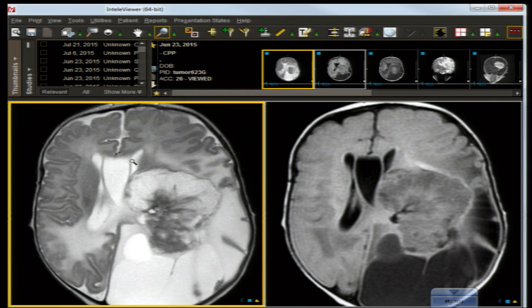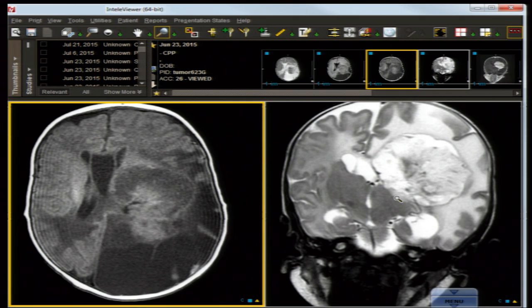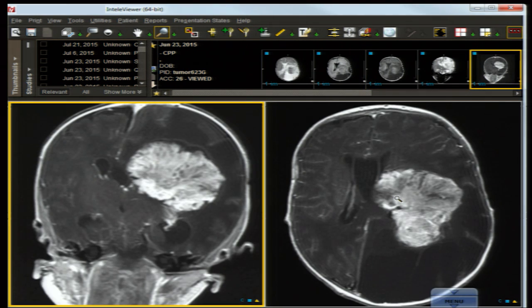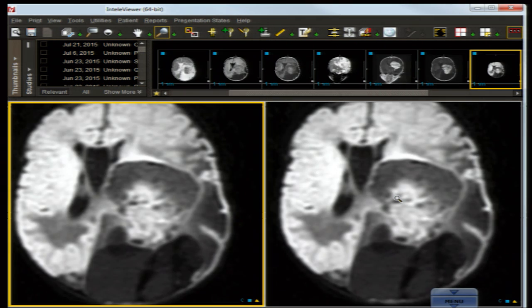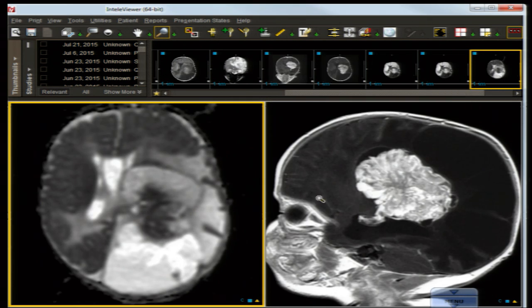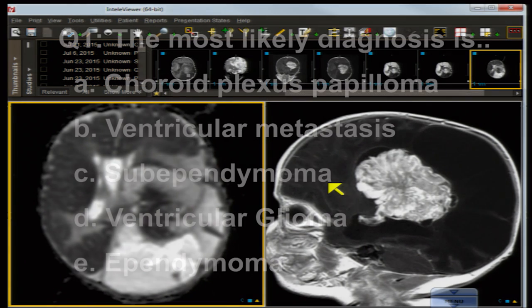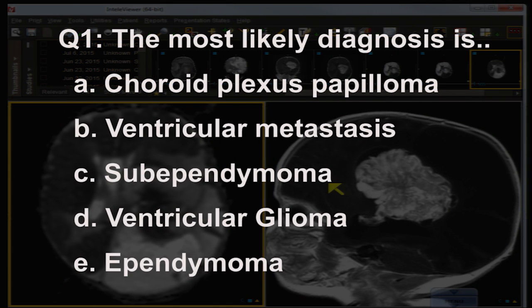Let's take on a few more brain tumors and intraventricular cases. We begin with this infant with macrocrania. We have an axial T2 spin echo MR with the presence of a mass among innumerable other findings, an axial T1 non-contrast, an axial FLAIR non-contrast, a coronal T2 non-contrast, a coronal and axial T1 with contrast, a set of axial diffusion restricted images, an axial ADC map parametric image, and a sagittal T1 contrast enhanced image.